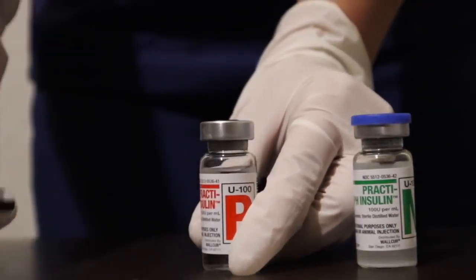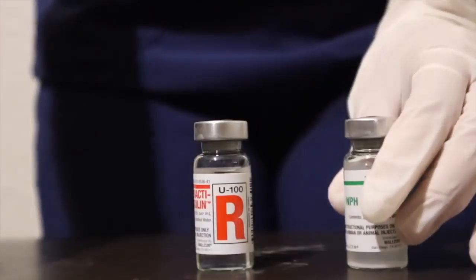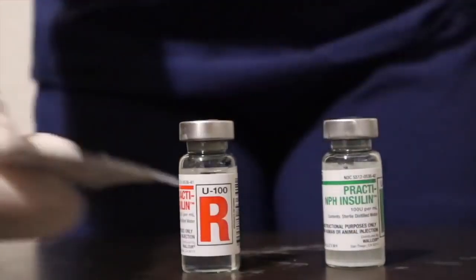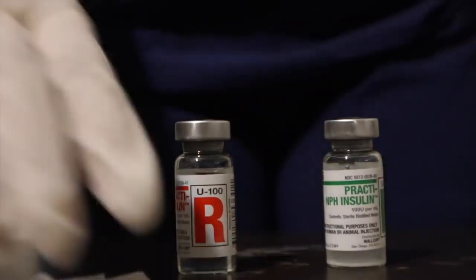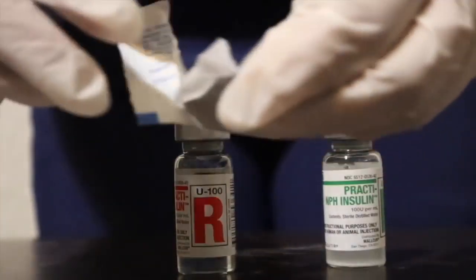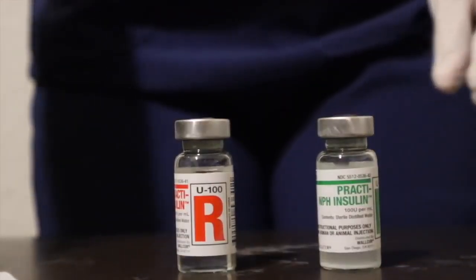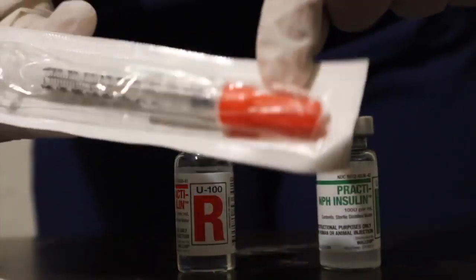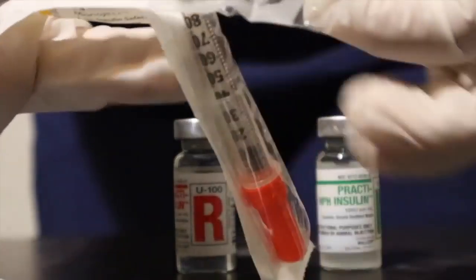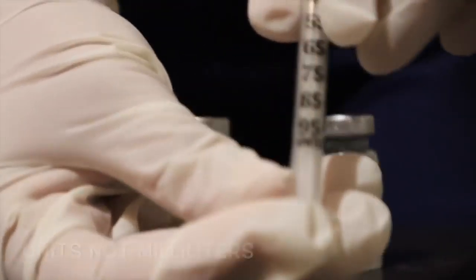Remove the cap of both vials. The tops of these vials are not clean, so I am going to make sure I alcohol wipe both of these vials for at least 15 seconds. Then I am going to grab the insulin needle, which commonly has an orange cap on like this. Remove the packaging — insulin measurements usually come in units instead of milliliters, so make sure you look for that on the needle.